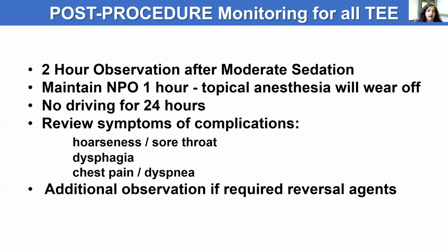And equally important is to monitor the patient after the TEE. So it's a 2-hour observation period for moderate sedation. You generally maintain NPO status for an hour to let the topical anesthesia wear off. No driving for 24 hours. And before we release patients, all symptoms and potential complications are reviewed.